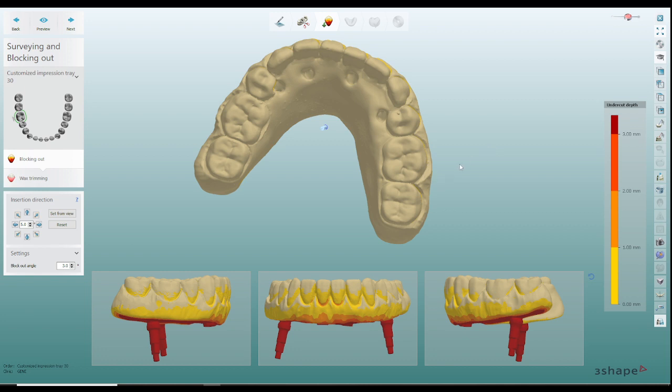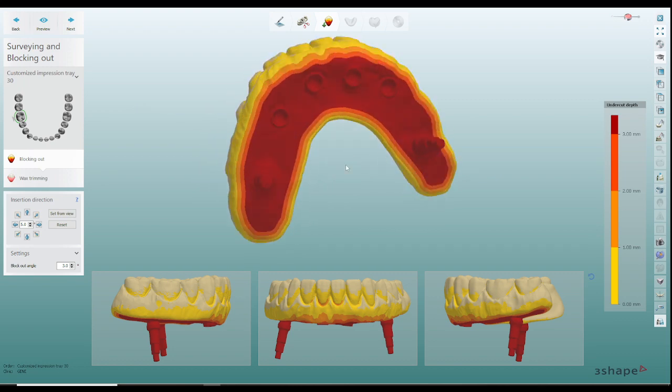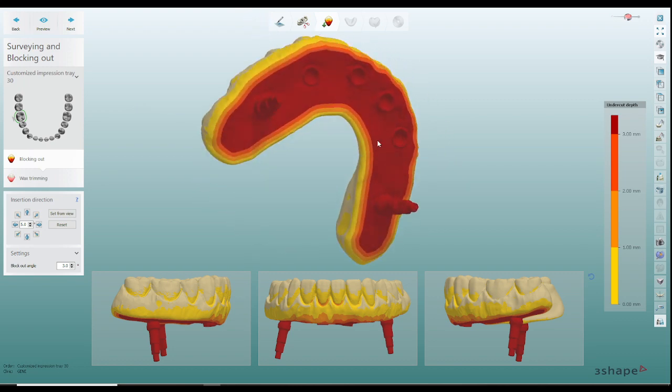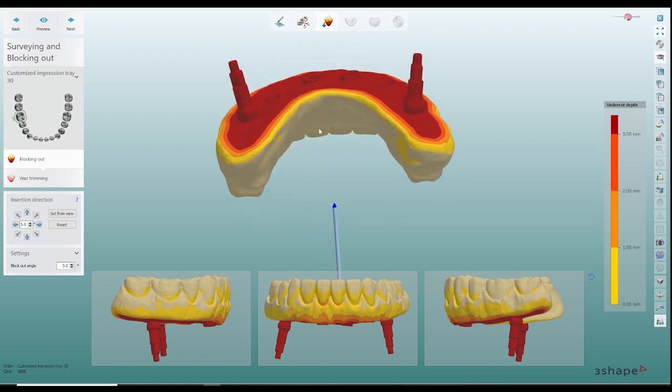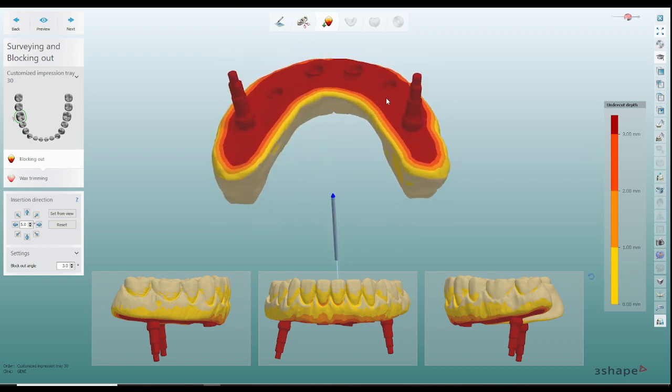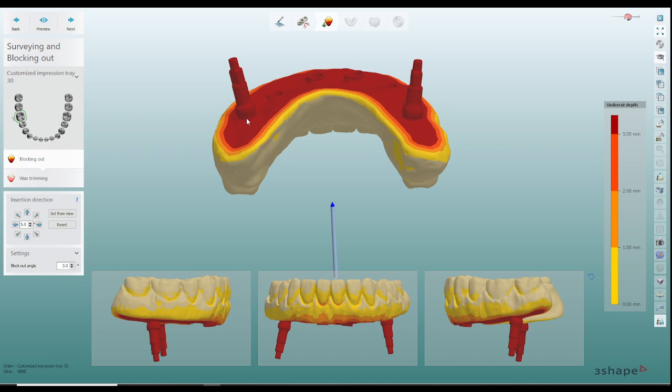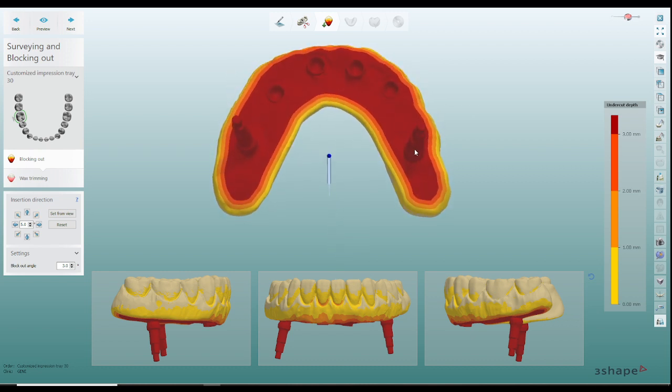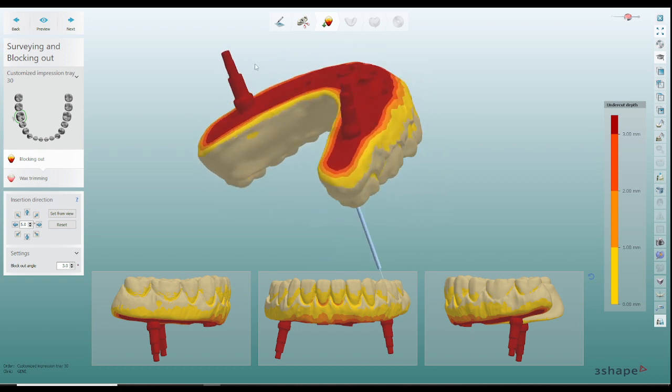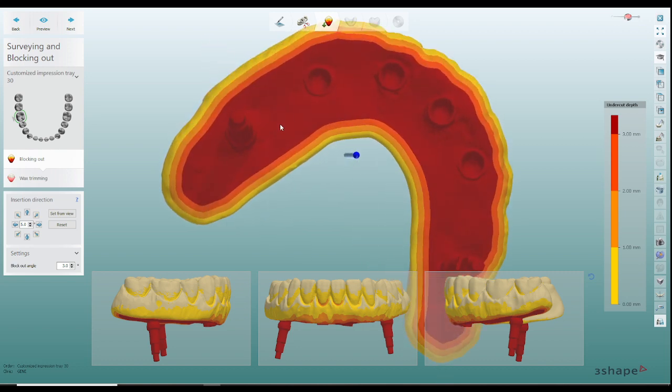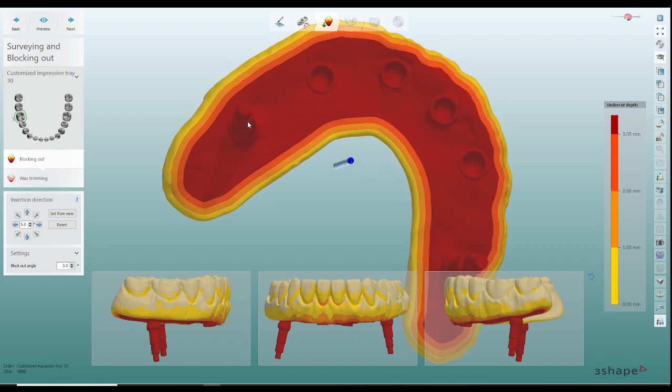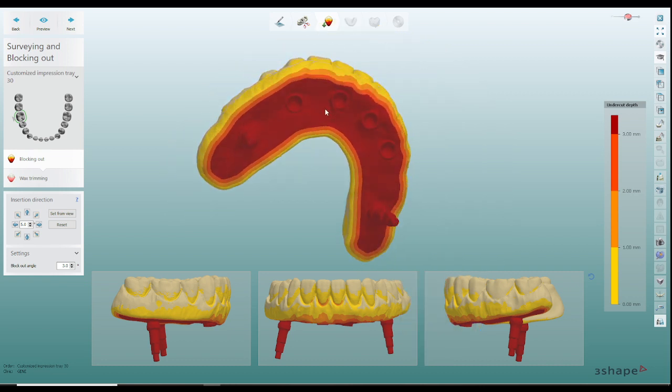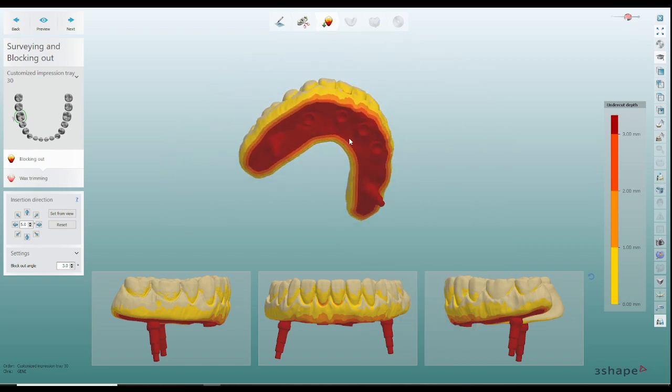This way what I'll do is once the case has been set up and verified and everything's good and before I process it I'll scan it but I'll scan it a little bit differently. So I'll take a couple of analogs and I'll attach those analogs just with wax to the actual interfaces and I have taken these analogs and modified them. I've rounded the ends out a little bit so it makes it a little bit easier for me to line up the access holes.